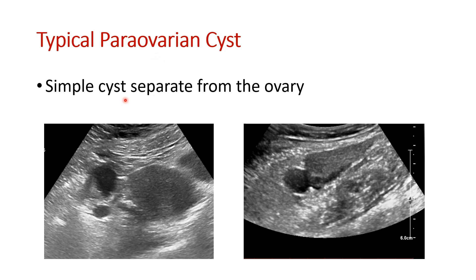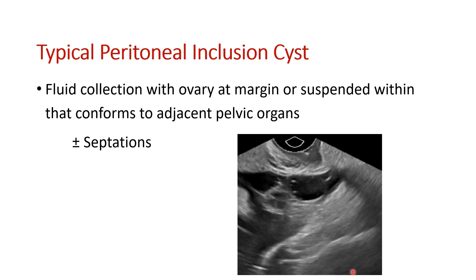Parovarian cysts should be separate from, but nearby, the ovary. Here you can see the ovary, and outside of it are two parovarian cysts — these are typical parovarian cysts. Typical peritoneal inclusion cysts are fluid collections with the ovary at the margin. This shows a partial volume of the left ovary and a cystic component in the peritoneum with septations — this is a peritoneal inclusion cyst.